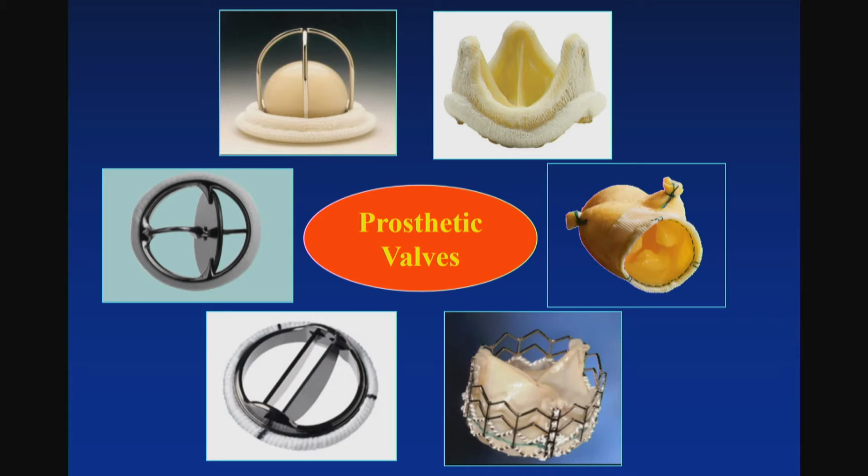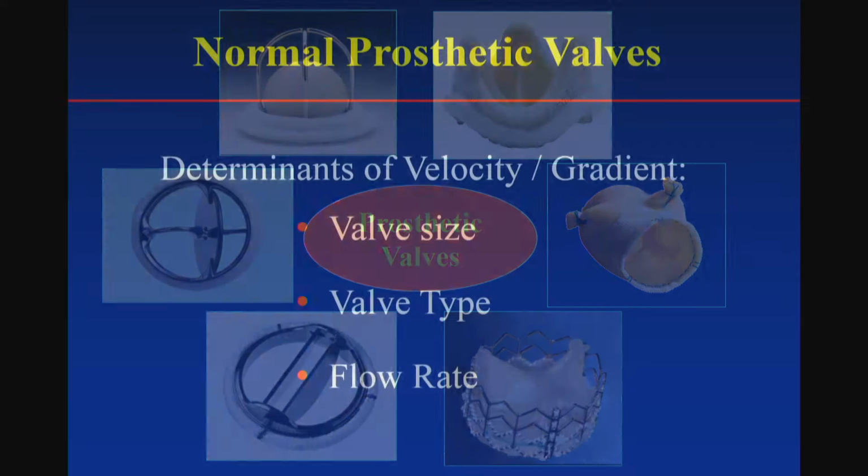This picture is just to show you the dilemma at times we have, be it the clinicians or the imagers, as to what we are dealing with. Certainly it's not the native valve. There are so many different ways of replacing or repairing valves, either percutaneous or in patients with homografts, which don't have any prosthetic material, and the image at times may look almost identical to a native valve. Nowadays, I think the vast majority of these mechanical prostheses are bileaflet prostheses, although we still see some remnants of the other different mechanical prostheses.